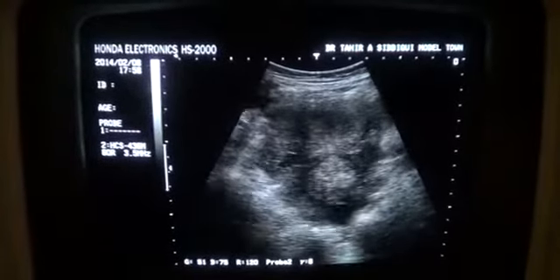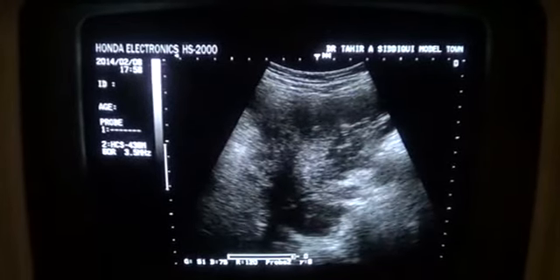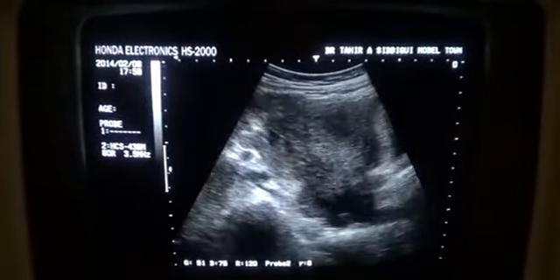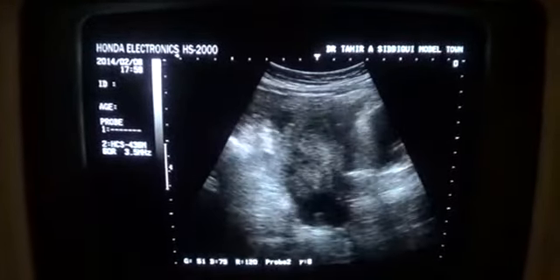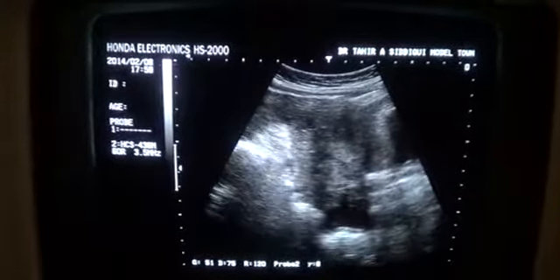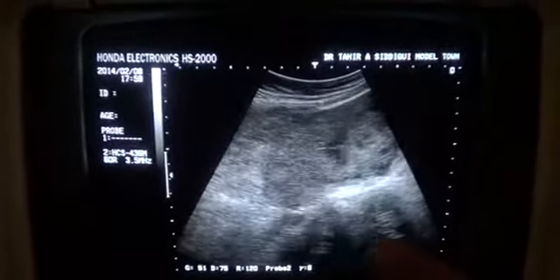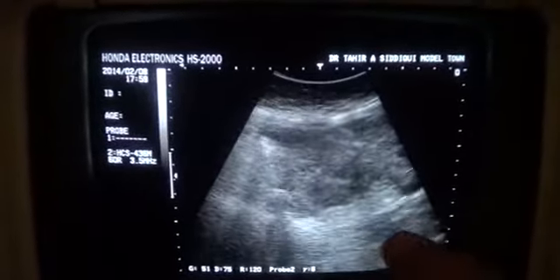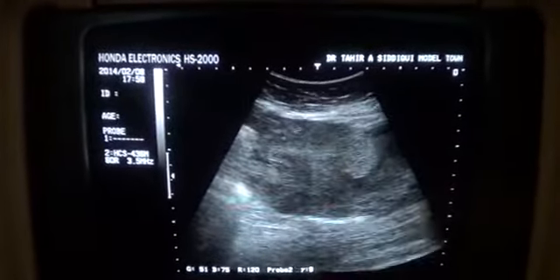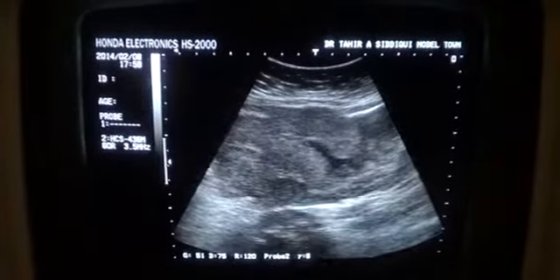Now this is the transverse section of the uterus. This area is the transverse section of the uterus. This is the uterus. These are the bowels, and with little maneuvering going upwards in the midline up to the umbilical region, you see these islands of echogenic masses.